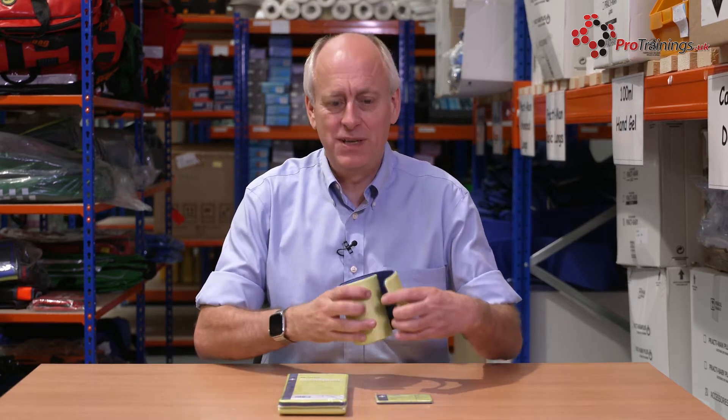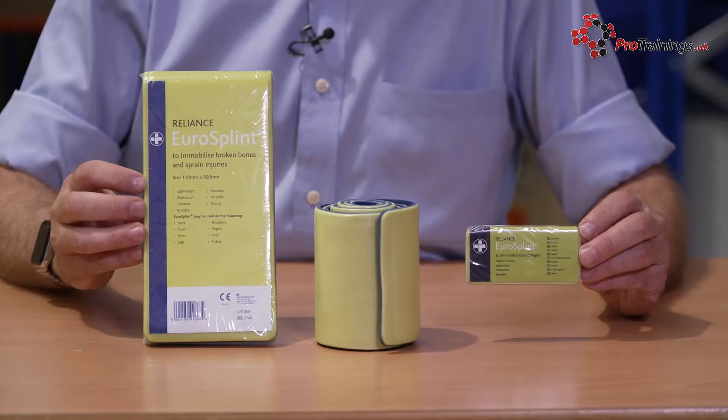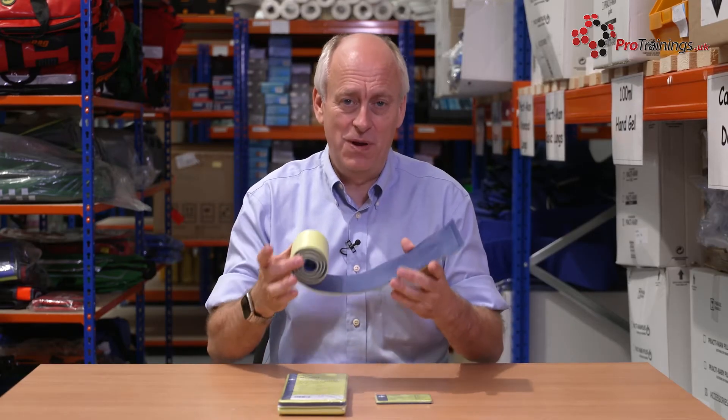This is a product called Eurosplint. It's a splinting material, and what it is, it's an aluminium metal inside foam. The advantage of it is you can actually mould it to different shapes. So if you're dealing with some sort of fracture, this is absolutely perfect for immobilising it.